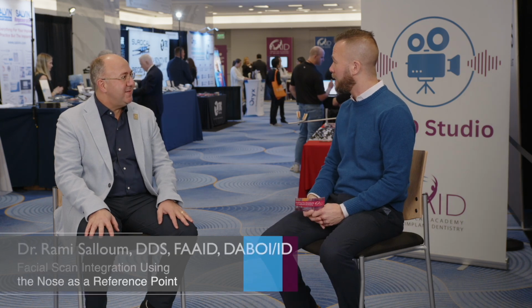I'm here with Dr. Rami Salloum, who has given a main podium presentation, facial scan integration using the nose as a reference point. So talk to me a little bit about what your presentation was about. My presentation was about integrating the facial scan to the intraoral scan, a step that can help us tremendously in aligning the intraoral scan to the face. And that will allow us to do facially driven prosthetic design. It's very beneficial into the digital smile design, the future of digital smile design.